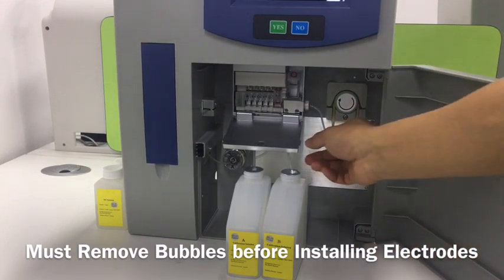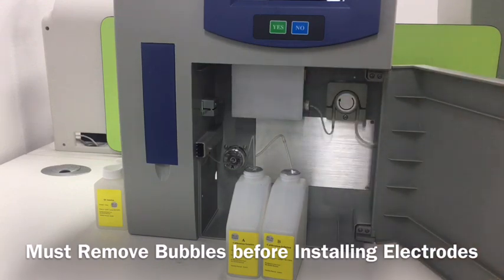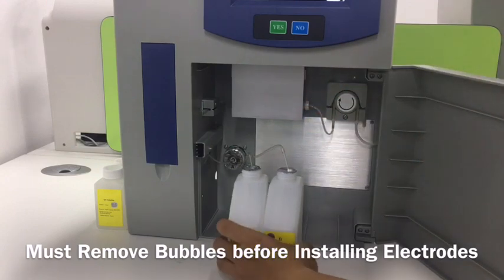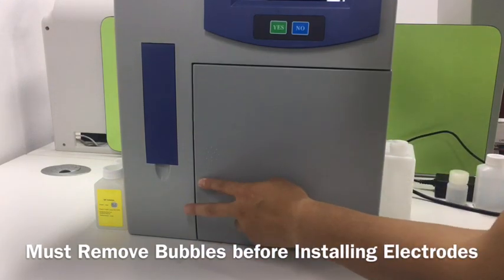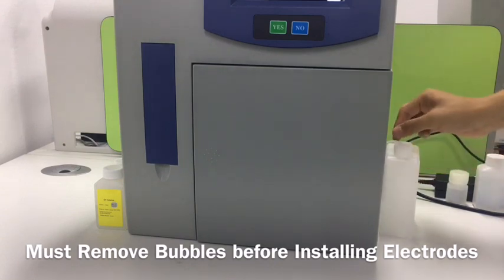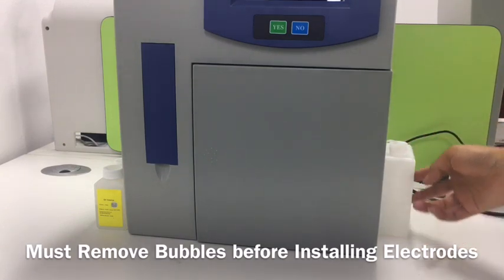Then we close the electrode box. This is solution A and solution B. We put the tube inside the box, then place them at the right place, and close the door. As we can see, the waste tube is outside. We put a container here to collect the waste solutions.